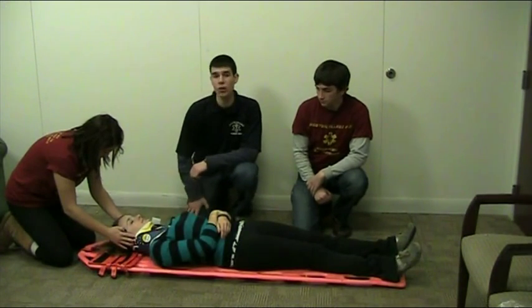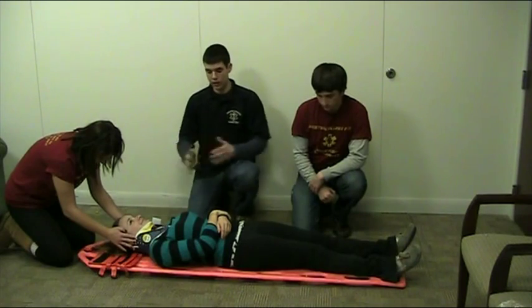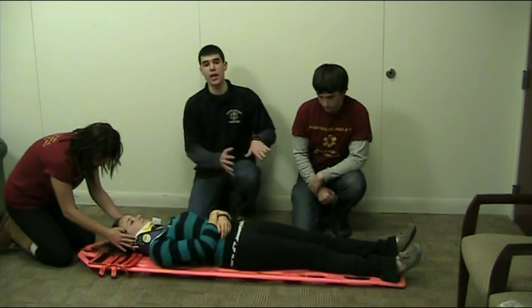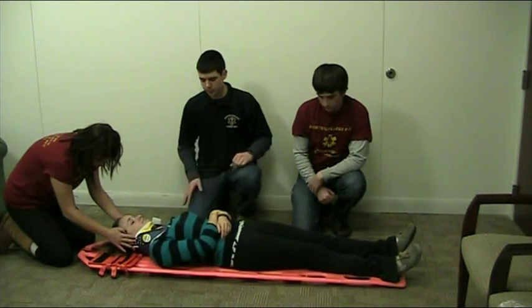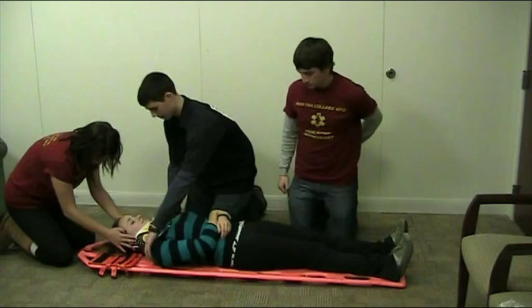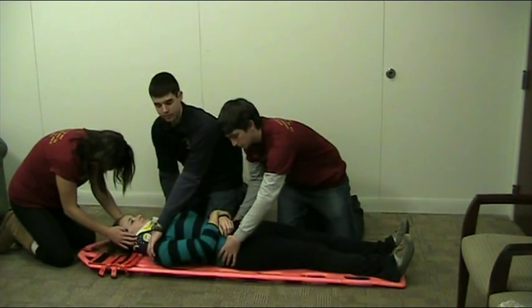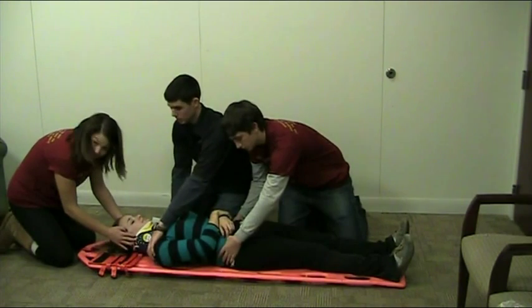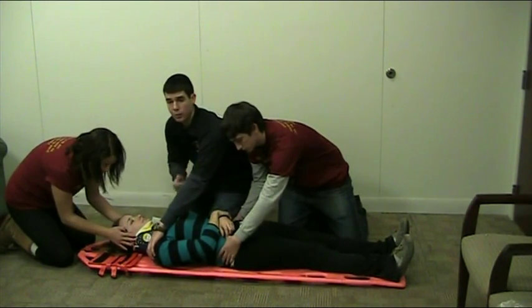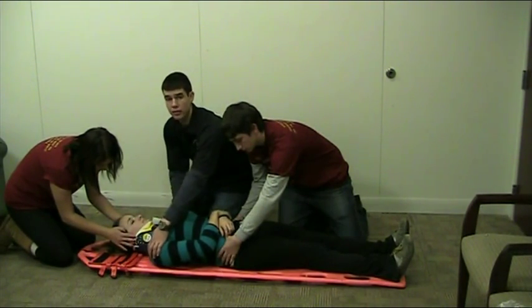In Kayla's case, she is a little off-centered, so we want to adjust her position. To do so, we are going to move her as a unit, vertically, parallel to the backboard. We are first going to have a motion going downward, and then back up. You have to position yourself so that one partner is at the shoulder and the other partner at the hips. On the head's count, we are going to move down, and then reposition our hands so that we move up, so that Kayla is better centered on the backboard.